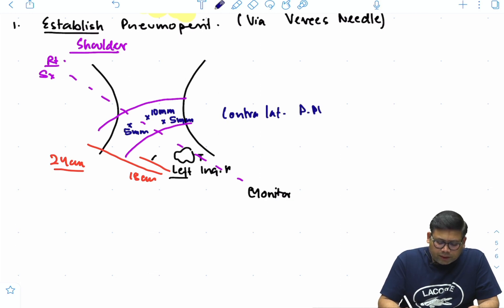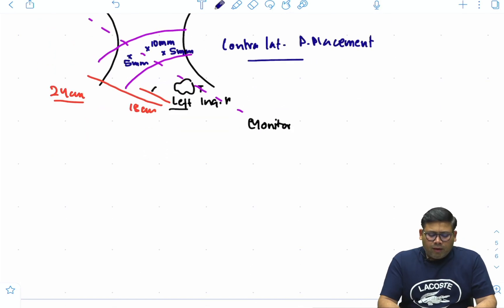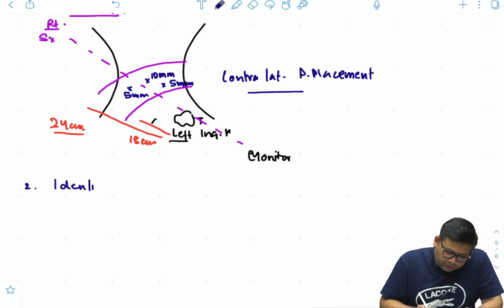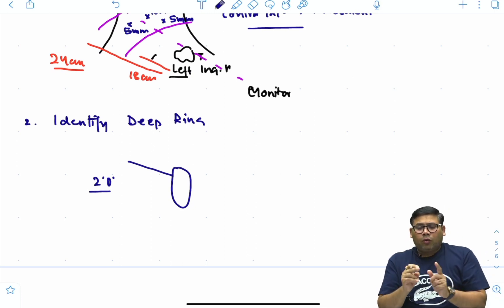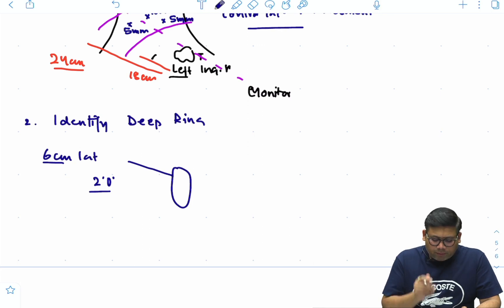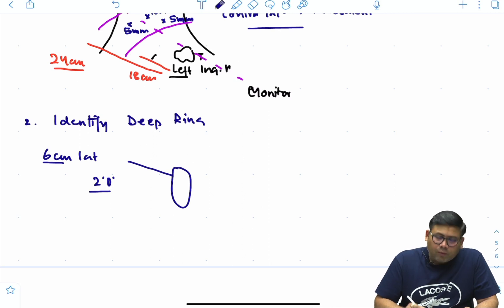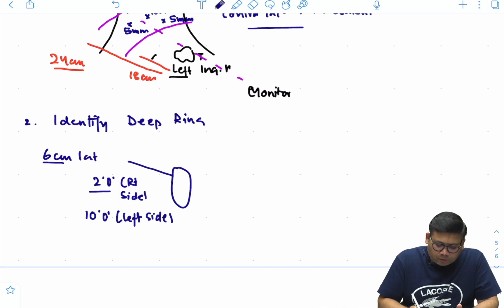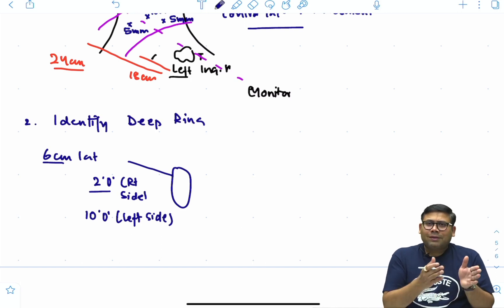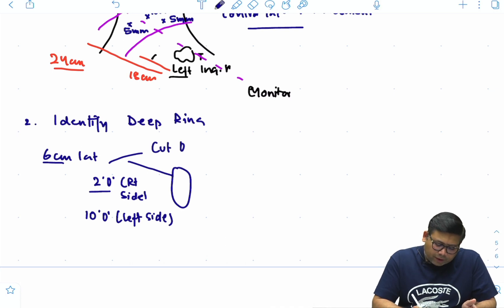Contralateral port placement is very important. Step two: identify the deep ring. At two o'clock position for the right side and ten o'clock position for the left side, go six centimeters lateral to the deep ring and cut open the peritoneum. I'm performing a left-sided hernia repair, so I go six centimeters above at ten o'clock and cut open the peritoneum.